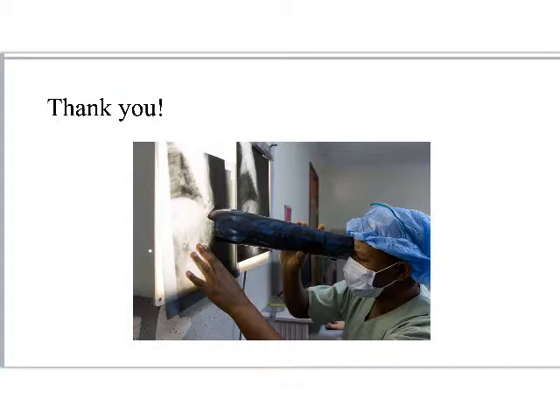And what they would do is grab a spare film, roll it up, in order to better see a fine detail in an area that might have some low contrast. They would call it hot boxing, right? They would use this tube to cut off veiling glare from other parts of the picture so they could more clearly see what they wanted to see, right? We don't have to do that anymore, right? Because we can just window and level it digitally.